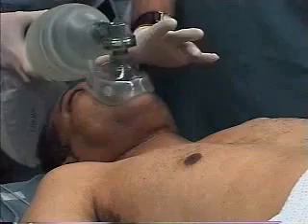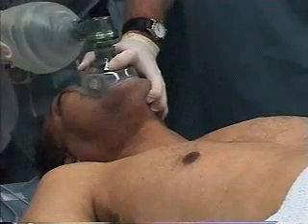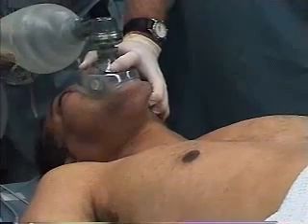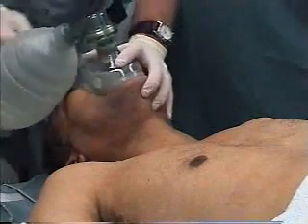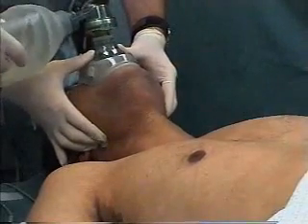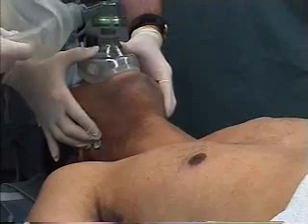Place the mask over the patient's nose and mouth, with your thumb over the patient's nose and your forefinger below the mask's ventilation port. Lift the jaw with your other 3 fingers. Squeeze the bag and observe for chest movement and misting in the mask. If there's a leak around the mask, use 2 hands to hold the mask and have an assistant squeeze the bag. If you're still unable to ventilate, the patient must be intubated.